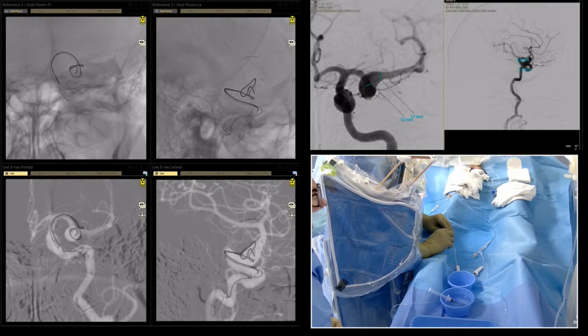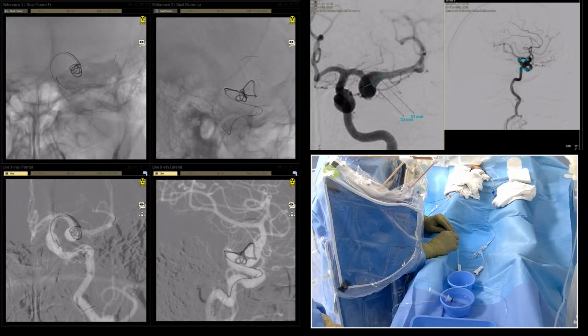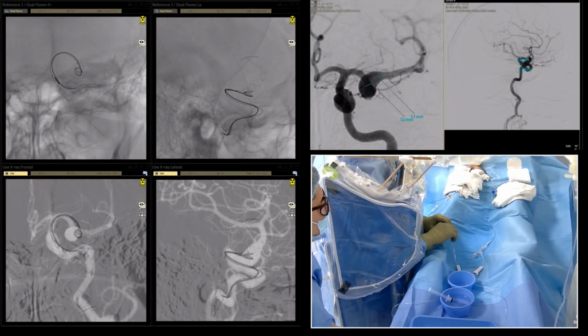It's lying like this, huh? It's going this way. And going this way. There is a branch this way. Don't need so much this way.